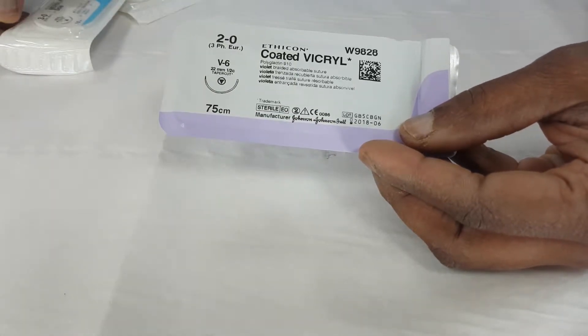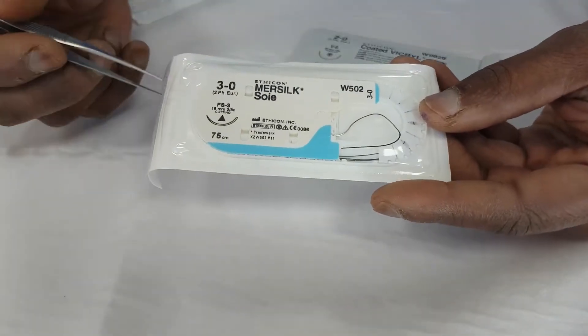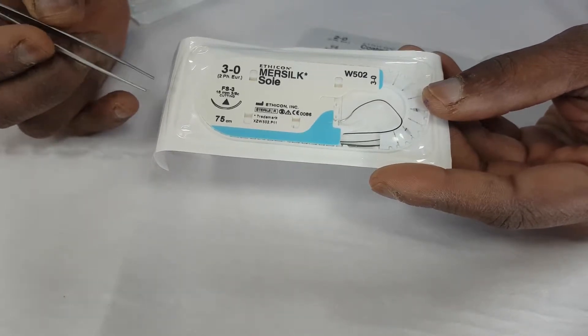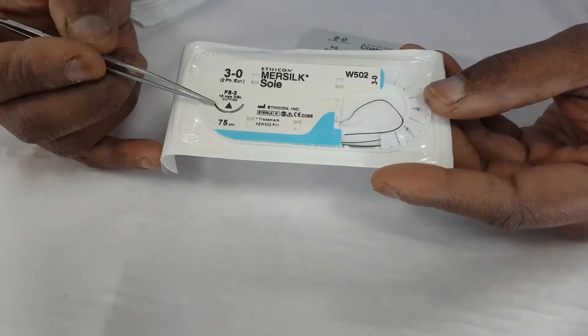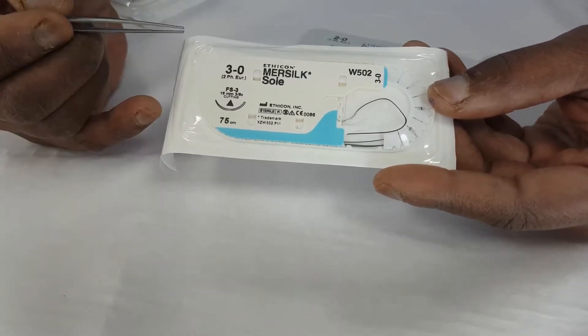If you compare this one, for example, which is Vicryl, to this stitch which is silk, a stitch we sometimes use for sewing in drains and things like that, you can see the needle is still a semicircle, but the cross-section of the needle is a triangle.